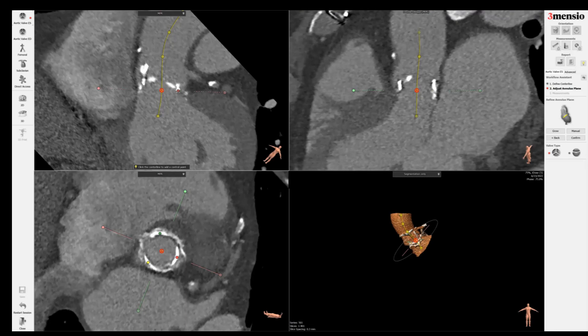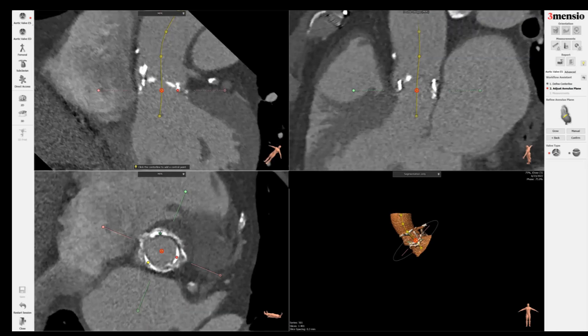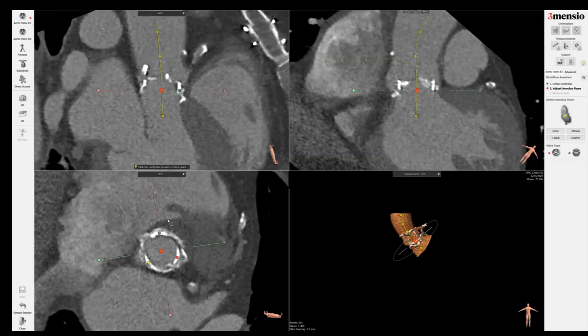Do the same thing with the red dot and go to the base as well. If the valve is symmetric, it should be 120 degrees apart from each other, the dots.